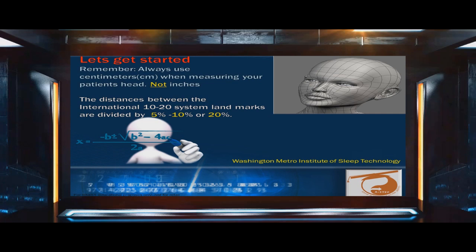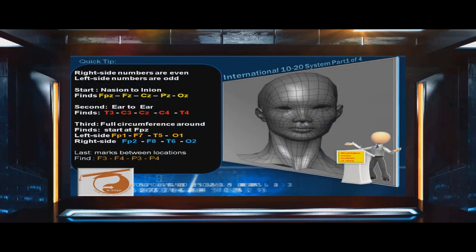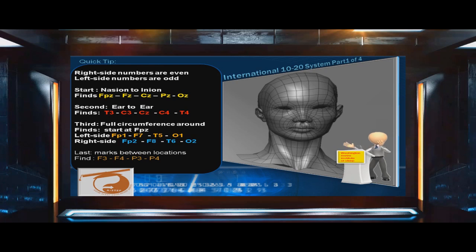Remember, always use centimeters when measuring your patient's head, not inches. The distances between the International 10-20 System landmarks are divided by 5%, 10%, or 20%. Quick tip: numbers on the right side of the patient's head are even, and numbers on the left side are odd.